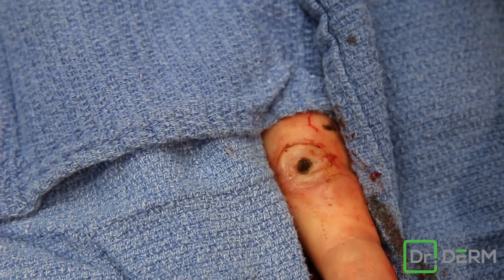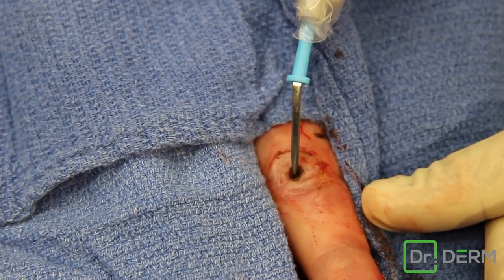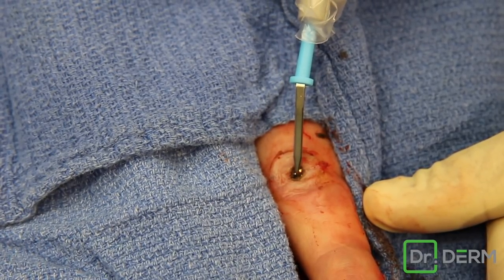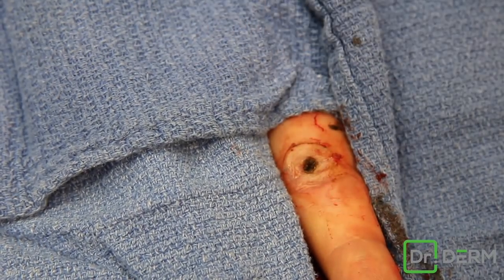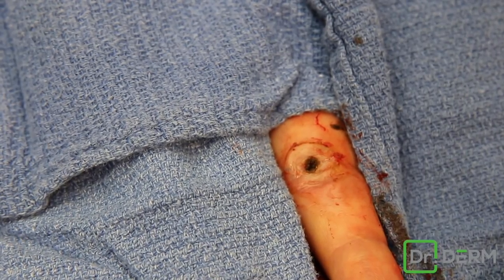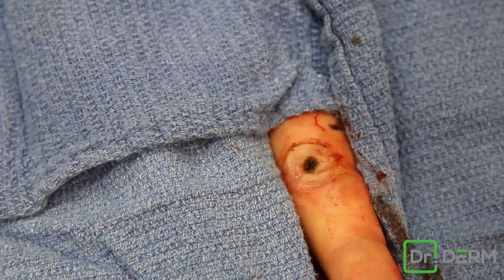I've talked about this in videos before — this is fulguration, where it arcs. When you touch it, it's electro-desiccation. Electro-desiccation causes a little bit more destruction, which in a pyogenic granuloma we need. But fulguration is actually better in most cases to stop the oozing because then you don't cause damage.